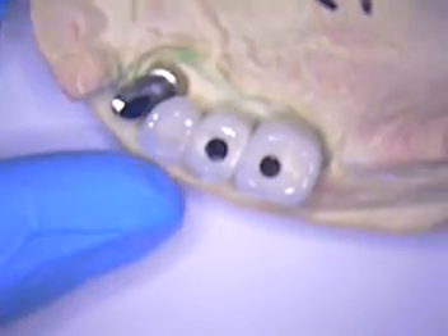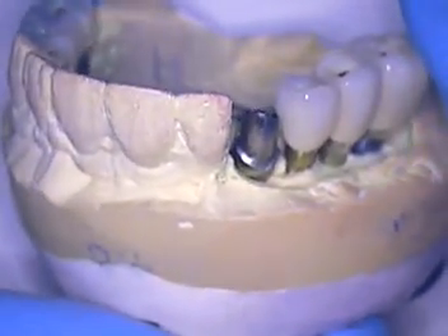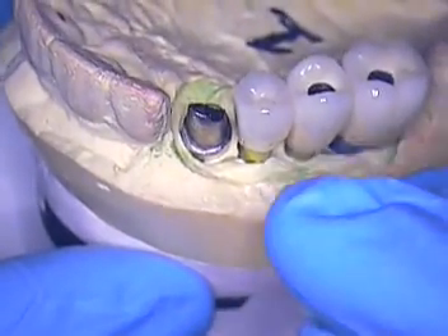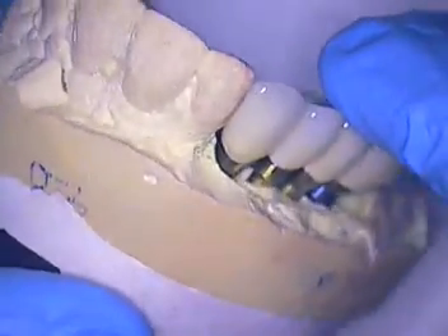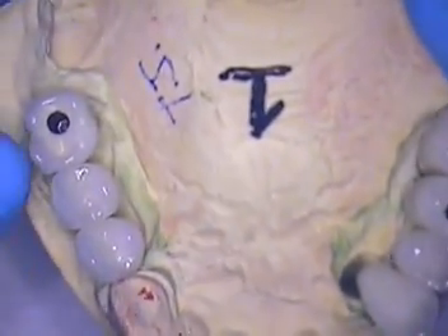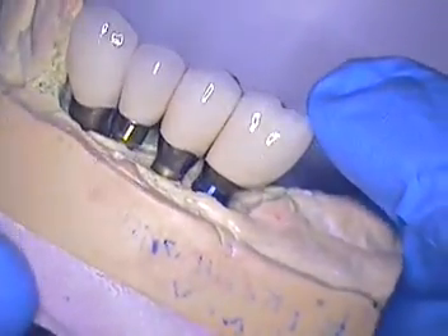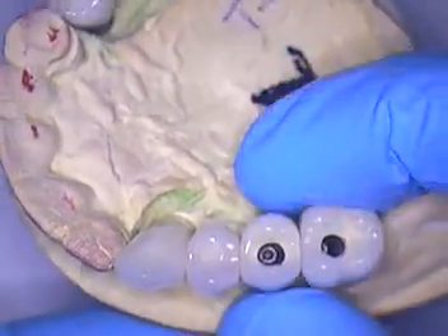This is an ongoing case and I'm going to go ahead and place it toward the end of this coming week. I'll try to film this case — I may not be able to narrate it; I might have to do an overlay of narration. Make sure you have good, broad contacts — I always ask my lab for that. I don't like to see contact points. You've got such a long contact between some of these implants, but you should really be certain you have good contact areas so that we don't catch food in there.